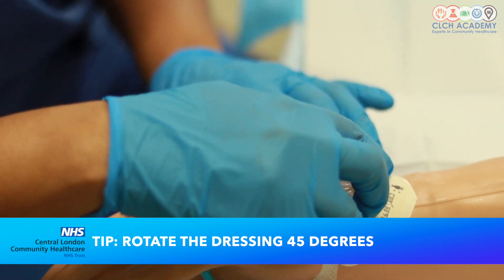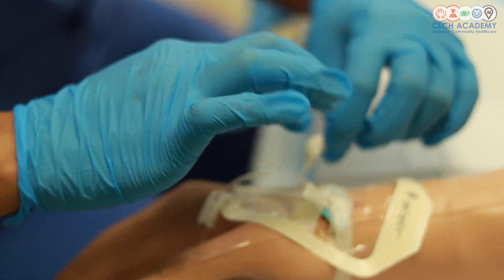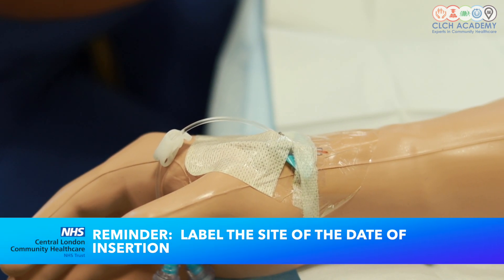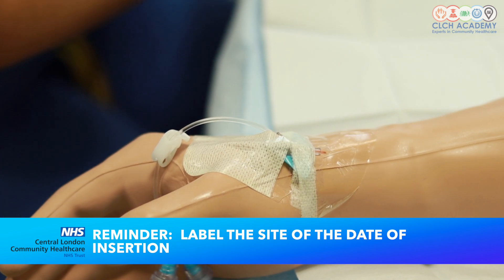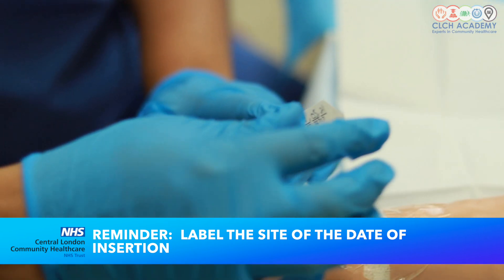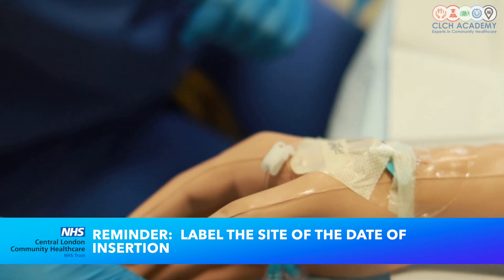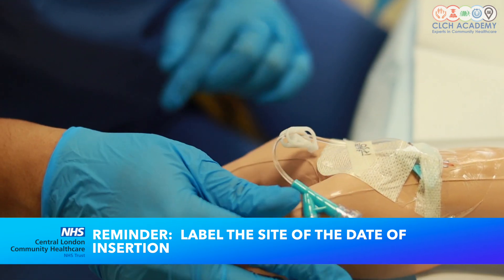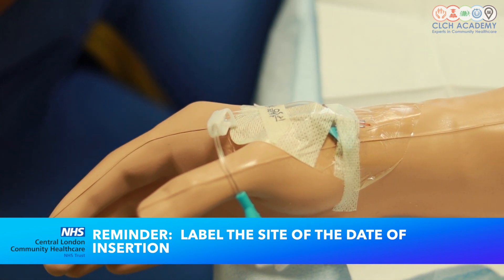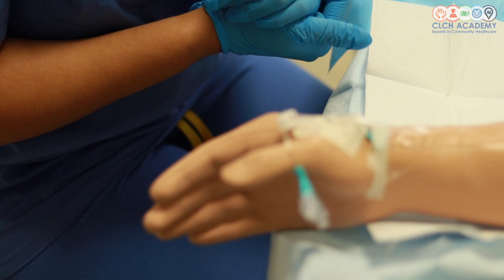Once that's nicely flushed I am now going to install the dressing that I had prepared earlier. For this dressing you need to rotate it 45 degrees to allow for the extension line, so that you're not putting the dressing on top of the extension line but leaving it free so it doesn't obstruct the dressing application. You need to be able to see a 10p area of visibility for your VIP scores. I'll add the date of insertion label, keep it secure facing gravity so that it doesn't occlude quite easily, and there you go — your cannula has been inserted, flushed, and it's clean. That brings us to how you would cannulate a patient needing a fluid replacement.